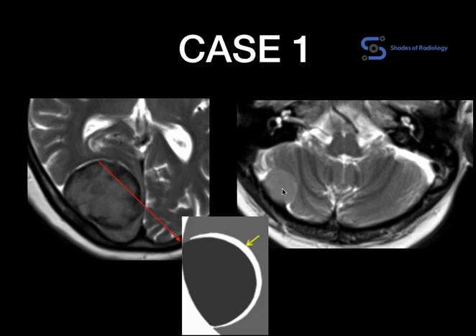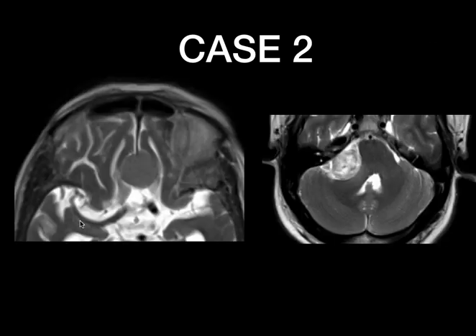You can see the base is broad in this case. There is also some focal cortical thickening compared to the adjacent area, representing hyperostosis in meningiomas. This is another case of a meningioma — a midline parafalcine meningioma which is bilateral.